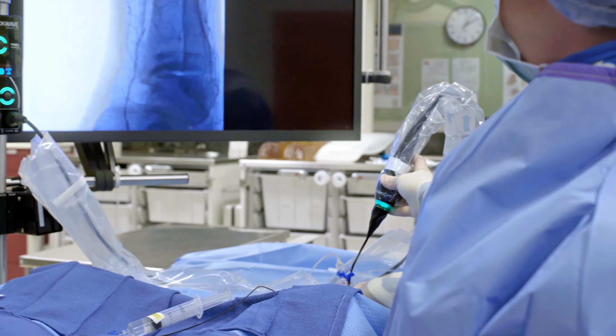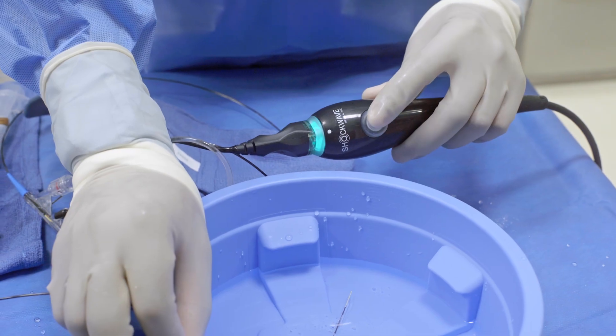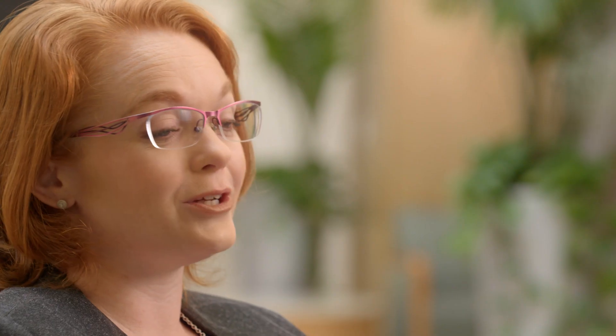The interesting thing about lithotripsy is that it penetrates deep into the walls of the artery and treats the deeper calcium — the medial calcinosis — much better. The technology of lithotripsy itself has really been a step forward, and every iteration that comes out is better, and it will continue to get better and we'll find more and more applications to use it.